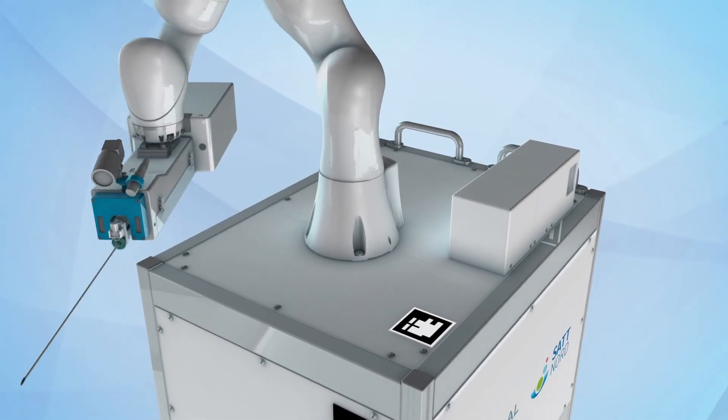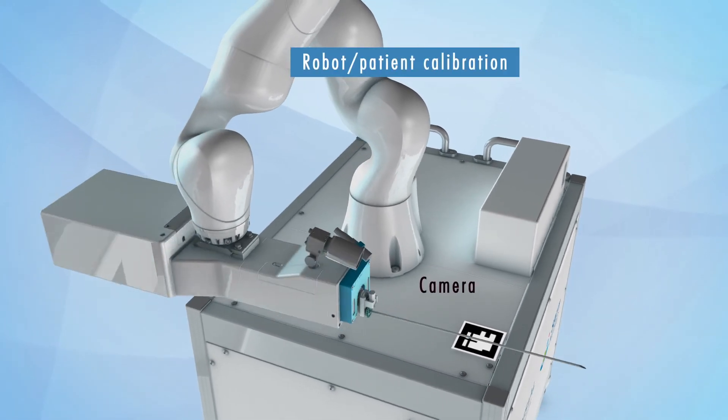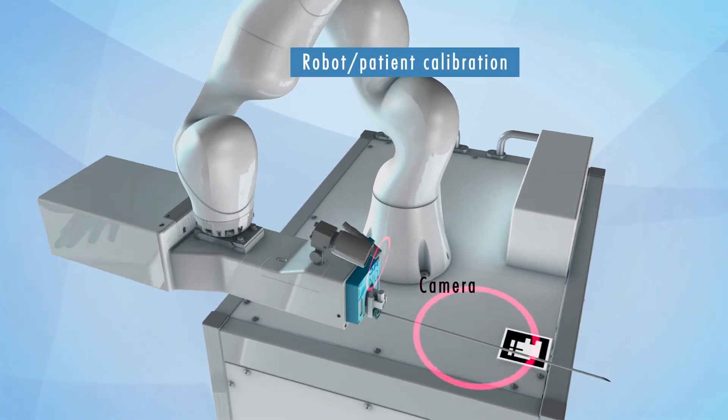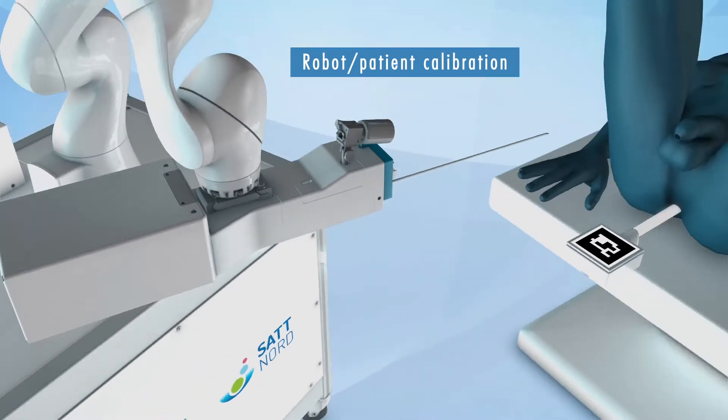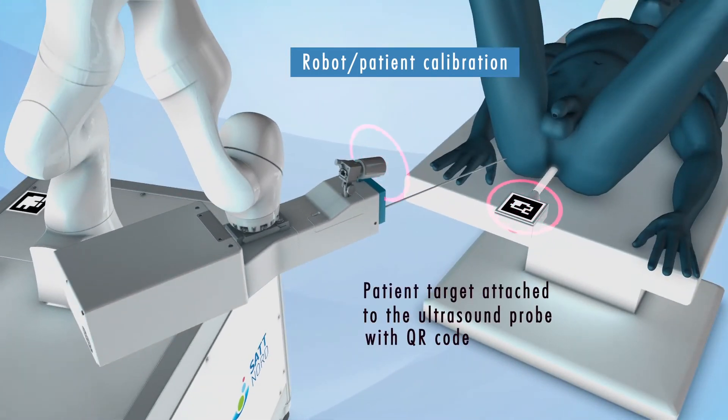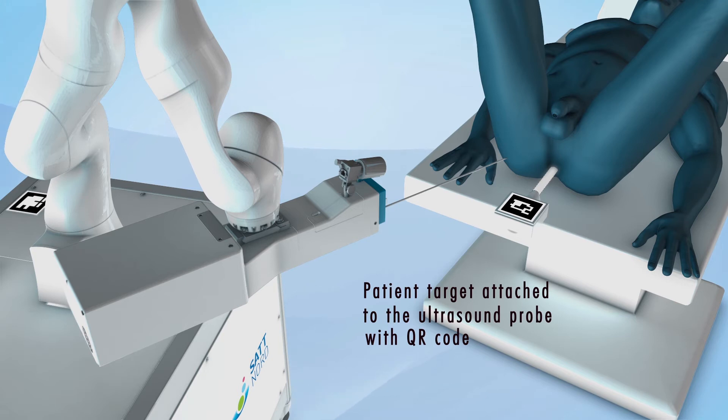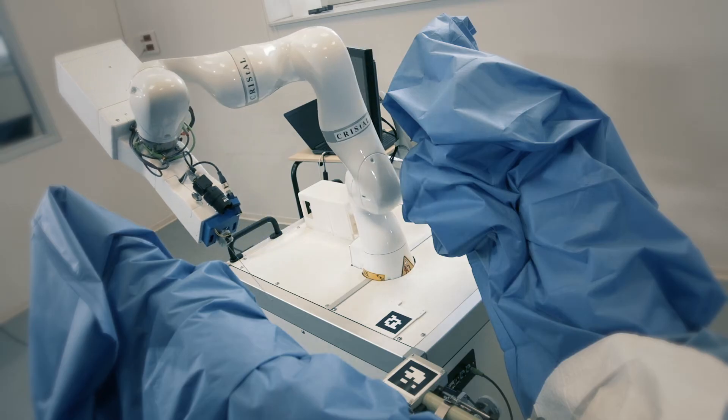To calibrate the robot, an algorithm based on image frame identification and transformation is used. This calibration is obtained by fixing the relative positions between the ultrasound probe and the robot base frame.